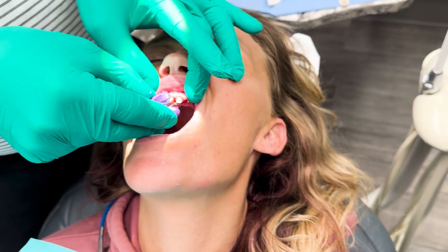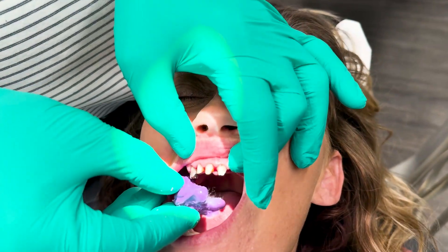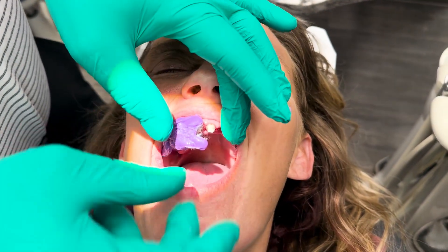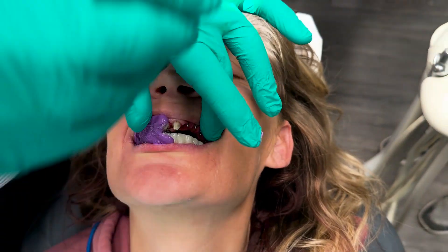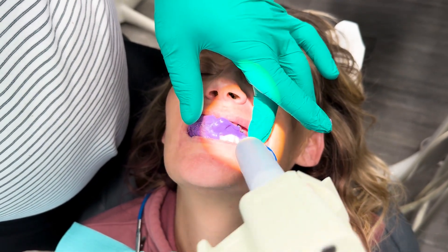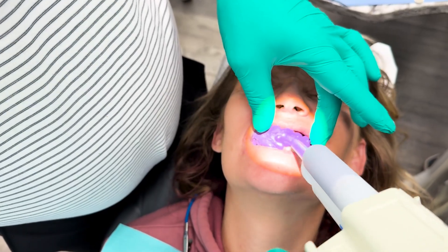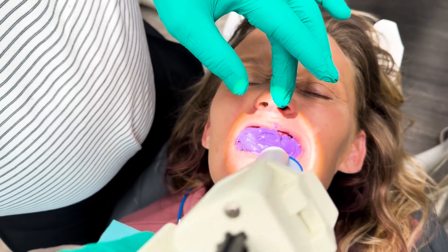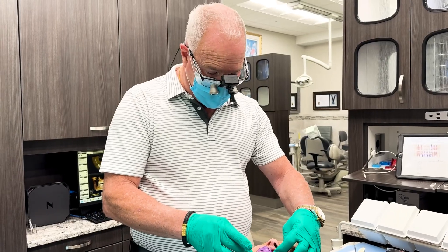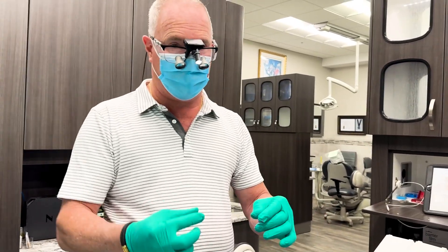Open for me — don't bite that. Let me get this back in. Now bite together again. Now we got that — now we're going to do the opposite side. Keep biting just like that. Now we're going to connect the two sides. Just open a tiny bit — okay, now close together. Nice and tight. So now we're connecting the bite together. Just hold that just like that. If we had fully edentulous where we had upper and lower implants and no natural teeth to bite on, then I probably would have used two cotton rolls and done the same thing.